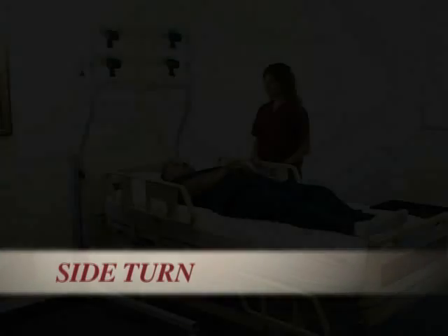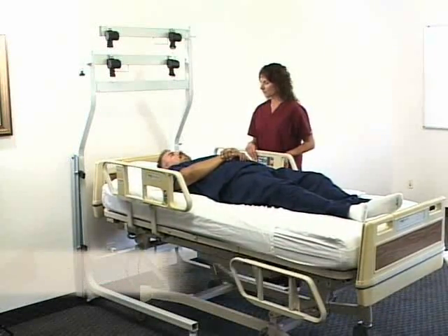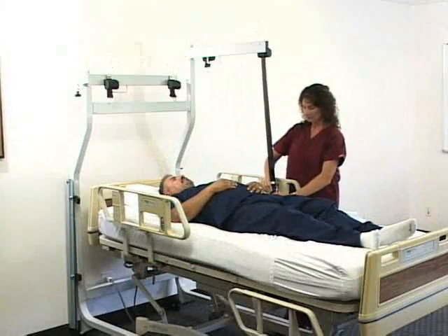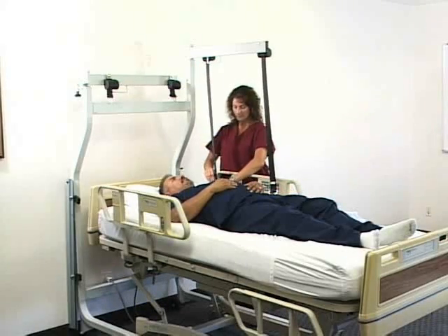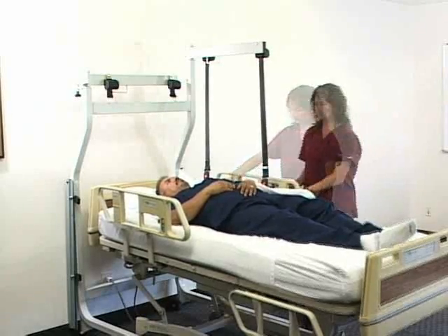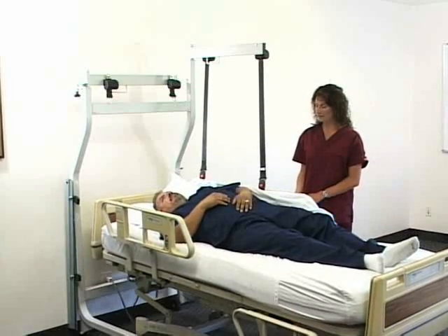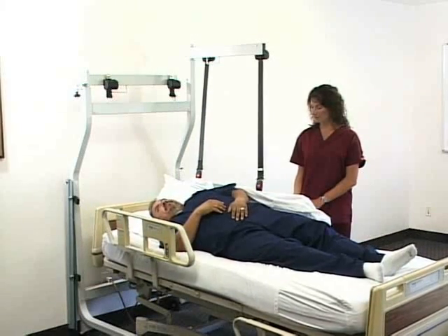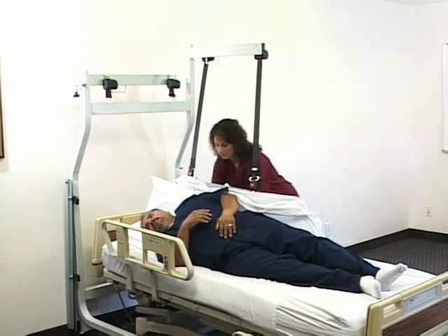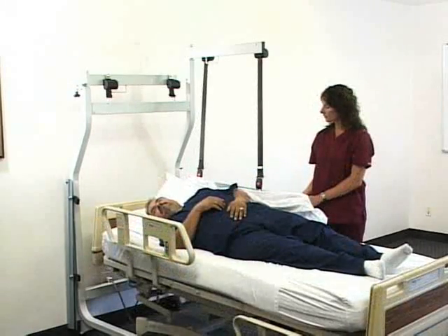To turn a patient onto his or her side, raise the bed. Pull down the web belt on the ErgoNurse and buckle it to the fabric clamp. Remove the slack from the belt. Lower the bed. The patient rolls easily and comfortably on his side. Use pillows to prop the patient in position. Raise the bed to provide enough slack to release the belts.